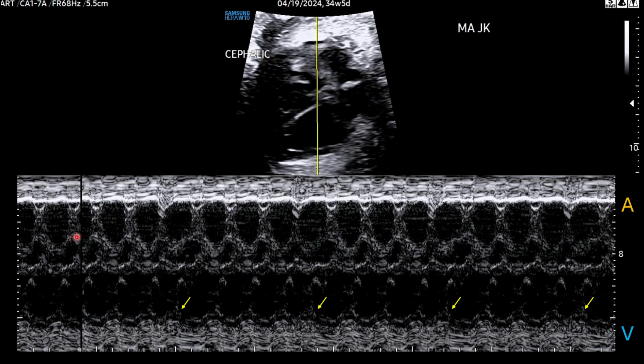Another really good tracing here, atrial activity on the top. You can see that A to A intervals are all normal, except for this break in the M mode, but you can see here all of these, including during the premature ventricular contractions, they're all regular, and then this PVC here, we see that this V to V interval is not normal and consistent with the other V to V intervals. PVC here, here, here, and here, not corresponding with the atrial activity. Isolated PVCs.